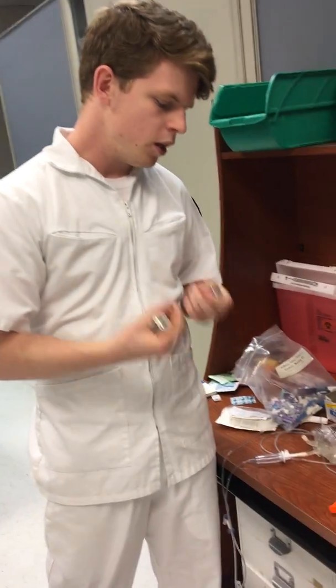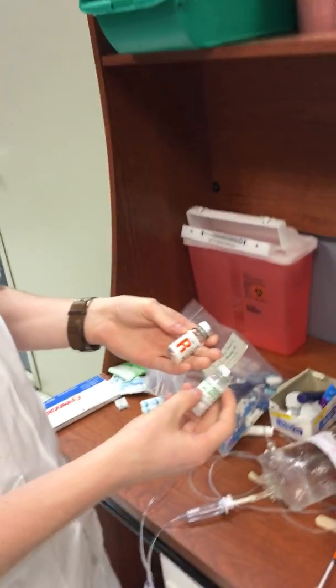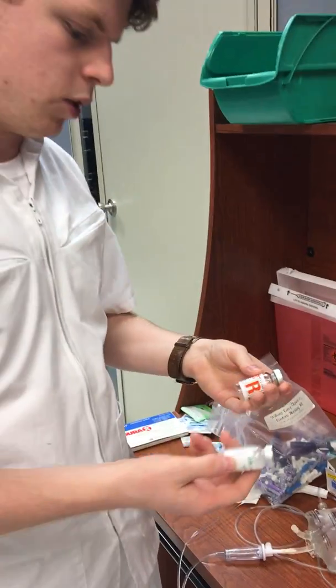Be careful not to mix long-acting insulin. Because if you mix long-acting insulin with any other type of insulin, then it defeats the purpose of the long-acting insulin. So for mixing the insulin, you have your NPH and your regular. The rule of thumb is clear before cloudy when you're mixing it in the syringe.